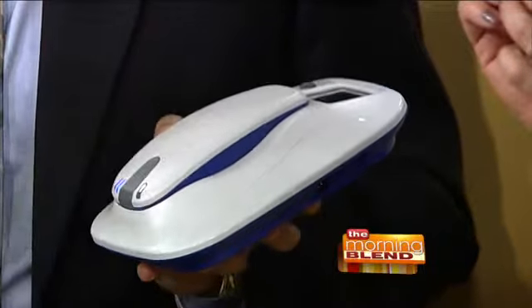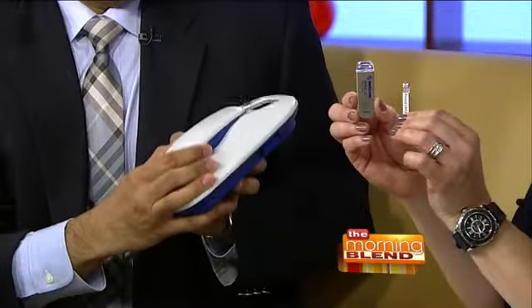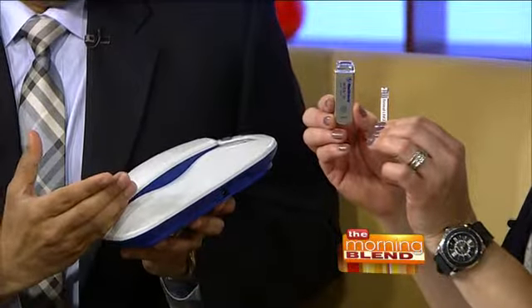From a doctor's smartphone even? Correct. If a patient has an abnormal heart rhythm that this device detects, it is transmitted through a patient monitor, which is set up in the patient's home and uses cellular technology. The information goes through this monitor to the physician through a secure internet connection. Is that only if the patient is at home? The patient needs to have this with them. If an episode occurs when they're away from home, when they get home, as soon as this detects the device, it'll send that information, typically every night. I also carry a little device which I can put up to the implant, and that sends it to the doctor. So if I have an episode wherever, I just put that up for a couple seconds, and it sends the information.